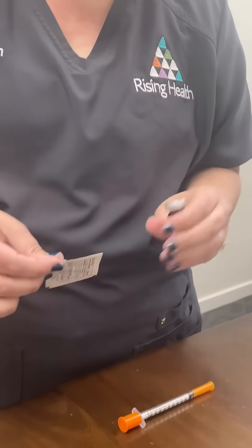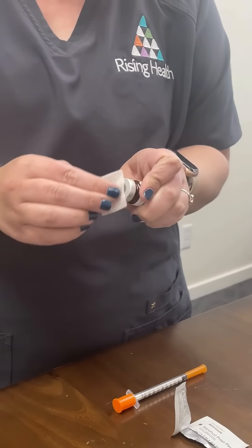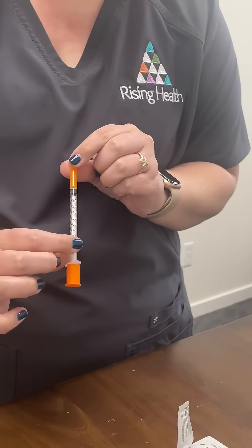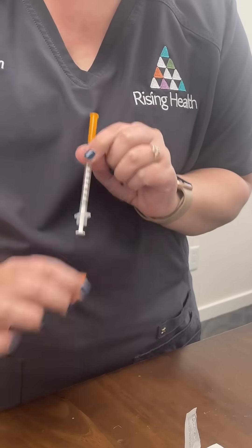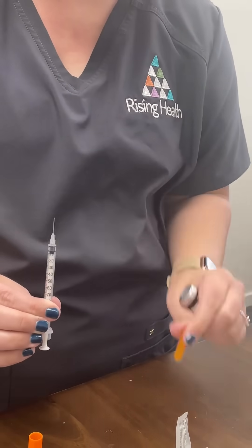When you go to draw up your semaglutide, you're going to open an alcohol wipe and wipe the top of the vial. Grab your syringe, pull off the bottom so you can pull it up, and the top so you can put the needle in.